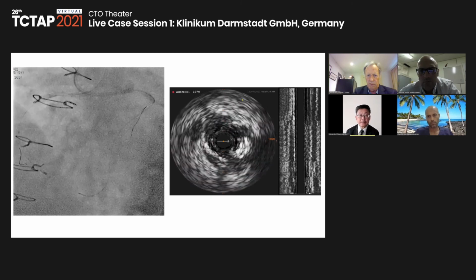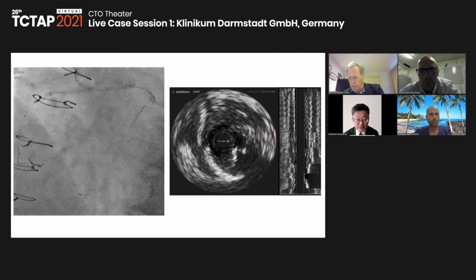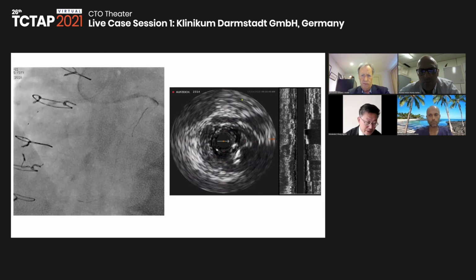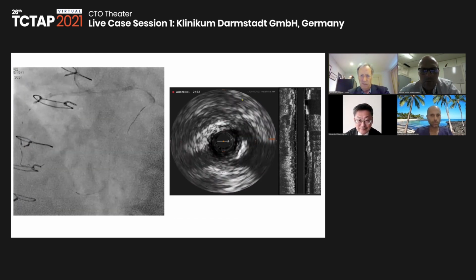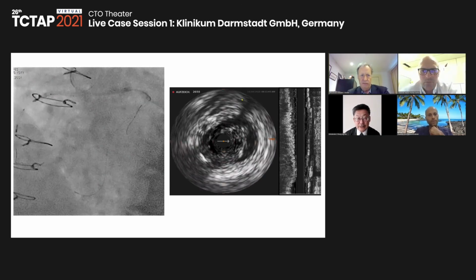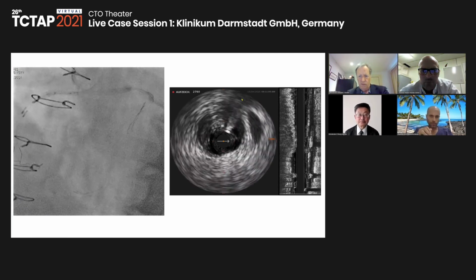Yeah, intraluminal. Just intraplaque. And this is eccentric plaque, I think. Maybe it's subintimal. That doesn't matter. Short segment. This is certainly intraluminal, and this is still distal to the AV branch. So here you see the AV branch coming, at 9 o'clock.